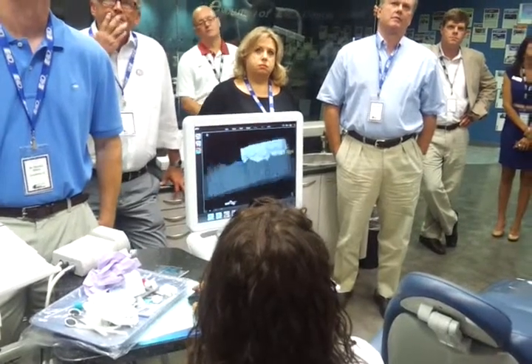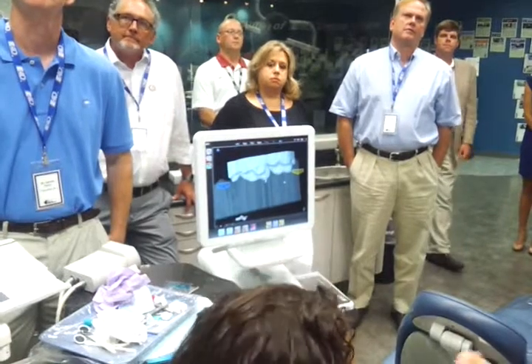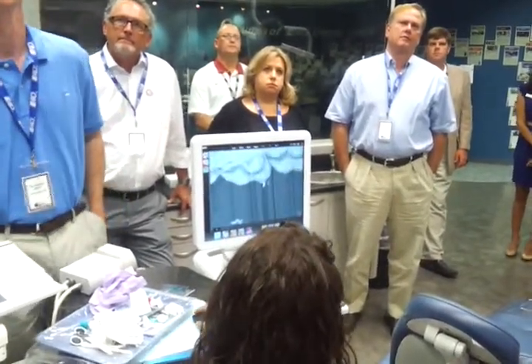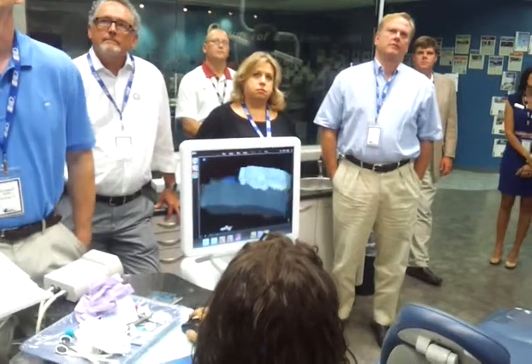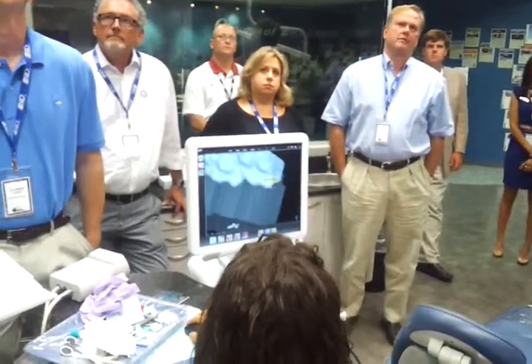What I want to do is just make sure from underneath nothing's hanging below my cusp tips, because the system may think it's a cusp, right? So I've got another little virtual tool. Here's my virtual little perio blade, or my 15 blade. I circle that little piece that's hanging down below. That's gone, I'm ready to go. I've got another little guy right there, no big deal. Let's just go ahead and trim that off.